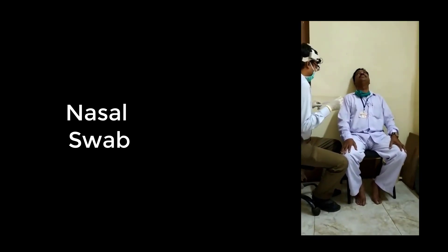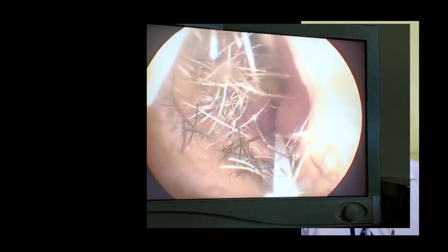I will now demonstrate the nasal swab collection. I am bracing the patient's head and will rest the forehead with my non-dominant hand, standing on the right side of the patient. I will enter the swab parallel to the floor of the nose, touch the septum, then the lateral wall, rotate for 2 seconds, and remove. This is the complete nasal swab technique.